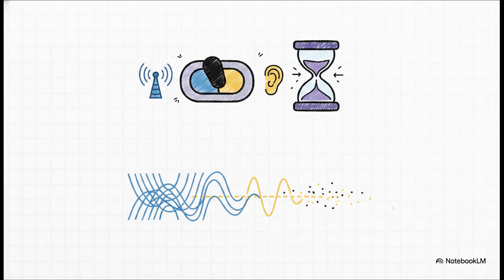Well, the downfall of this sequence lies in the harsh realities of hardware and real-world physics. First off, the sequence demands a minimal TE, meaning we have to measure the FID signal instantly after the 90-degree pulse. But electronically, that is incredibly difficult. The machine's hardware actually needs a tiny fraction of a millisecond to switch from transmit mode over to receive mode, which creates this mandatory delay period.